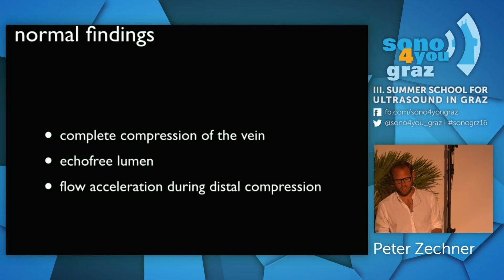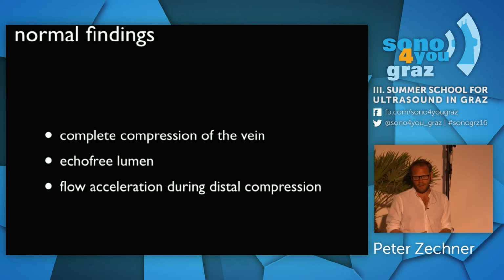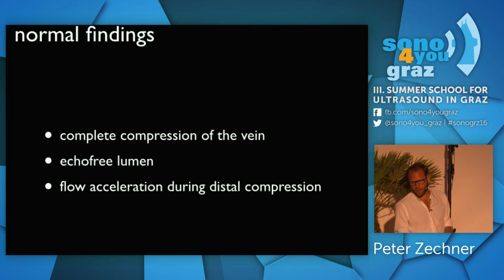So what are the normal findings? As I already mentioned, complete compression of the vein. The lumen is echo-free, and if we compress the lower leg, we can see some flow acceleration on color Doppler more proximally. Okay?